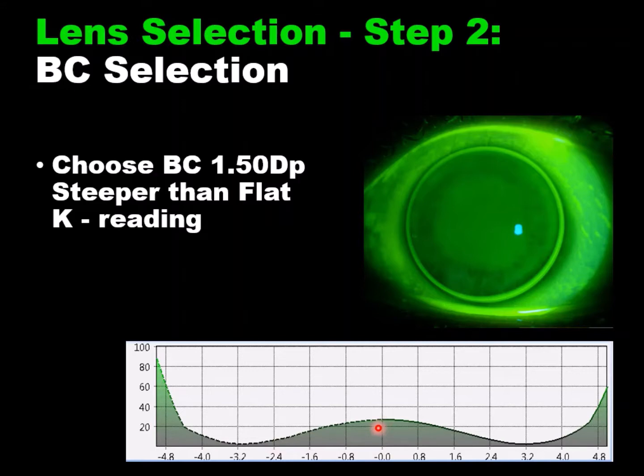It is not at all typical to see apical steepening with the Apex Multifocal, and that may be because it has such a high asphericity of the back surface. So you have this very thin fluid layer in the center which tapers very quickly until it reaches its landing.